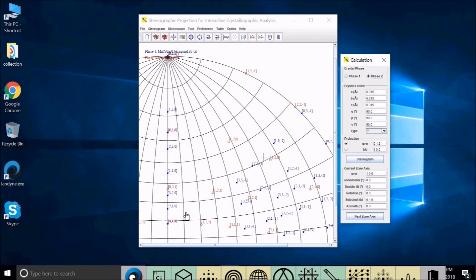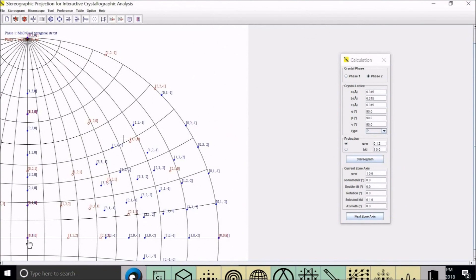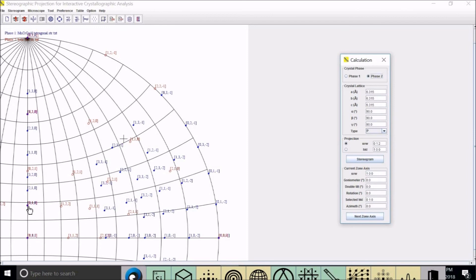And there are other points where the two phases have a fixed orientation. These points can be seen where blue dots and red circles overlap. The next one is this one, and the last one is this one, and also here.